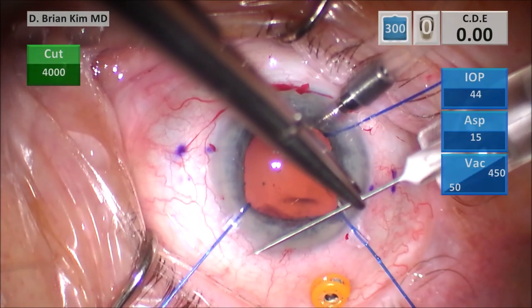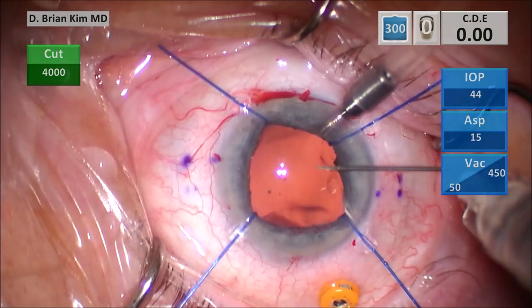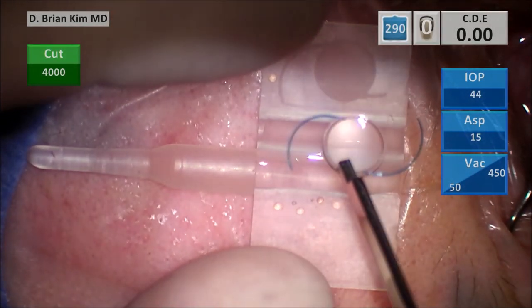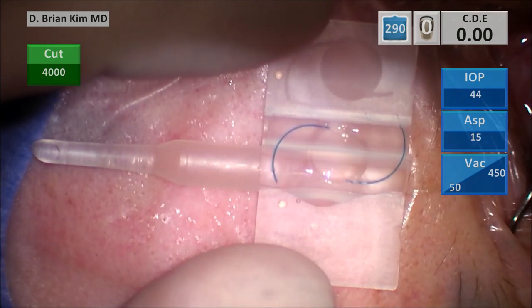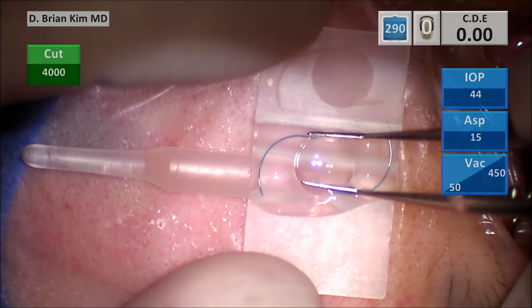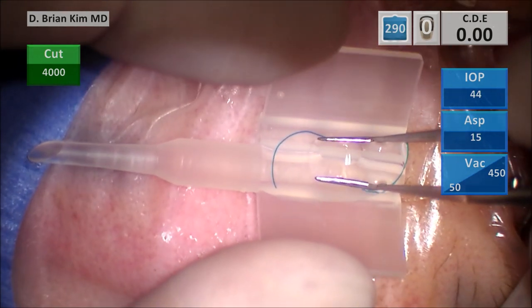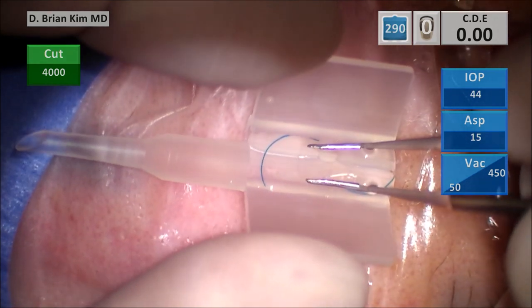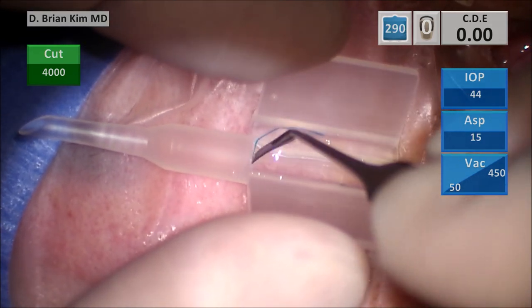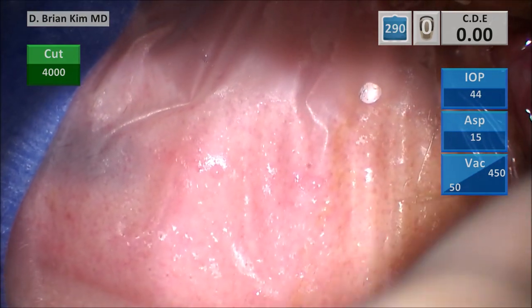I'm going to bend my needle. This is the right needle — bending about 9mm from the tip, making sure the bevel will be facing the approach of the haptic. This is the left-side needle, bending at the hub. I'm going to load the lens myself — this is the J&J Sensor lens. I'm putting it in according to the configuration of the cartridge, using angled McPherson's as I push the edges together, making sure the optic is cinched down. The leading haptic must be pointed into the barrel — that's the key. If not, it will crimp and be damaged. Close the cartridge, place it into the injector, and you're ready.